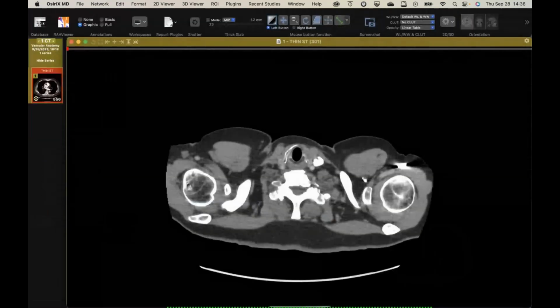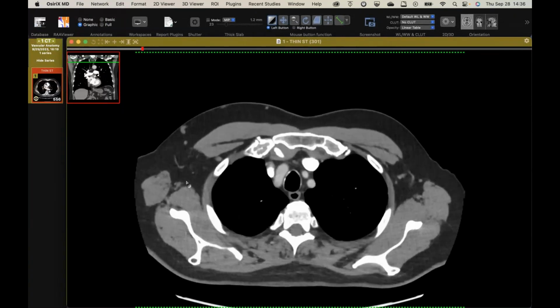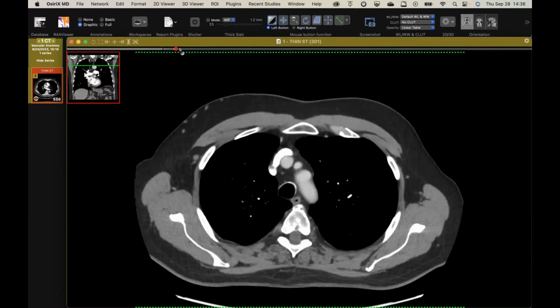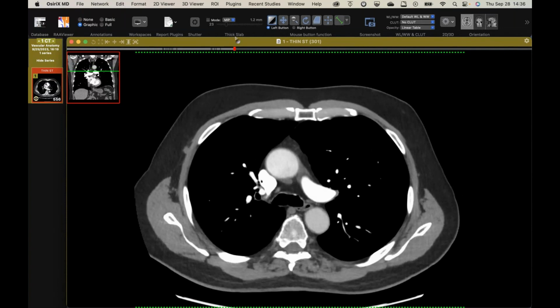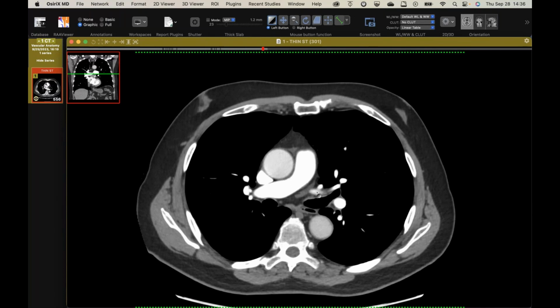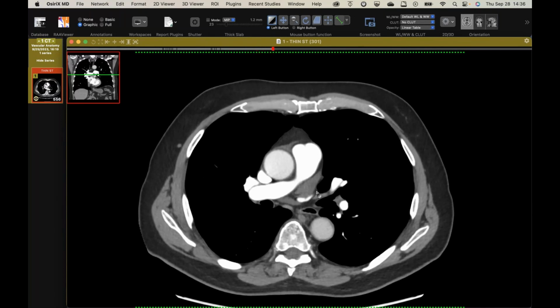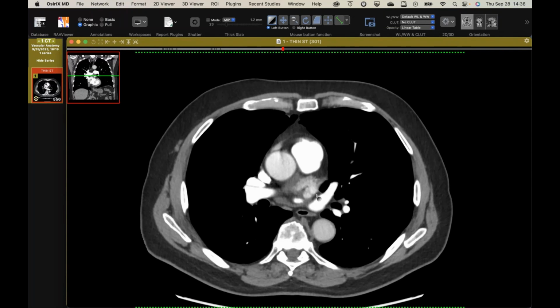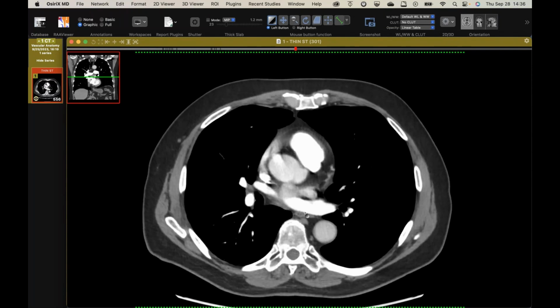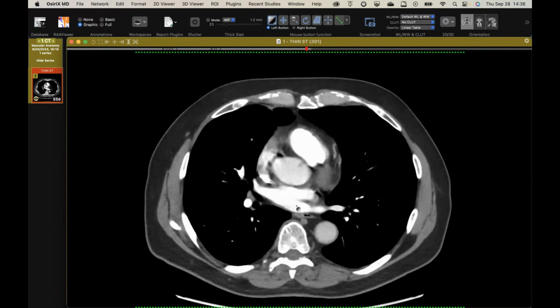All right, this was just kind of a cute finding that I have not seen. Seth mentioned that he'd seen this before, but I don't think Travis had. So I can't remember why this was done. It was just a routine chest. But I saw this vessel right here that looked like a superior pulmonary vein, but it was kind of in a weird position, almost looked like a top vein. You can see it comes in and inserts on the top portion right here of this sort of common antrum of the left pulmonary veins.